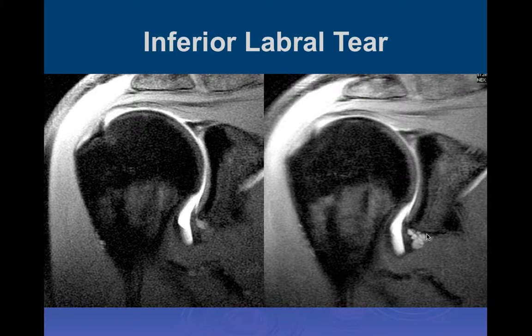Okay, so it looks like it's an irregular inferior aspect of the labrum. I don't see any marrow edema on the ABER view. Again, it looks like there's irregularity in the labrum, and it looks like a sharply marginated line. And then it looks like there's some cystic changes adjacent to the... Yeah, actually. Okay, so labral.